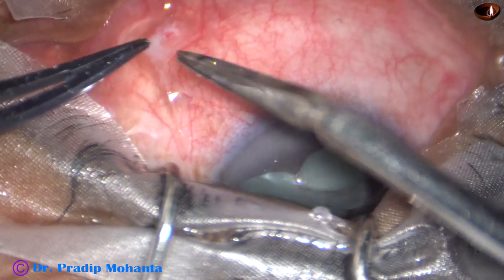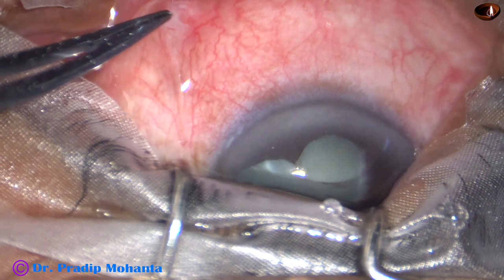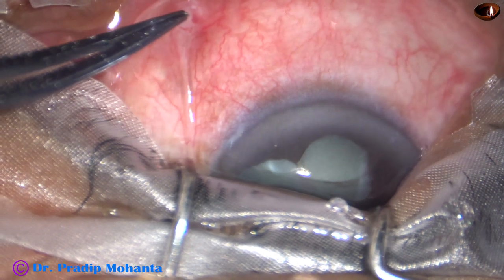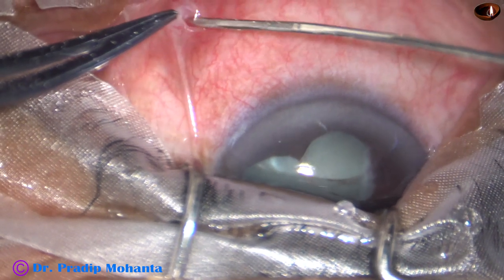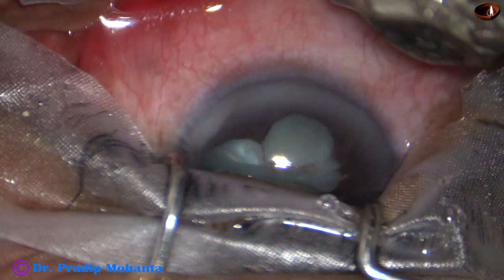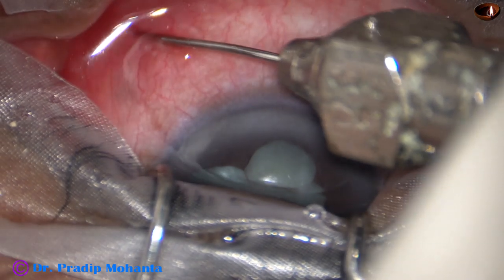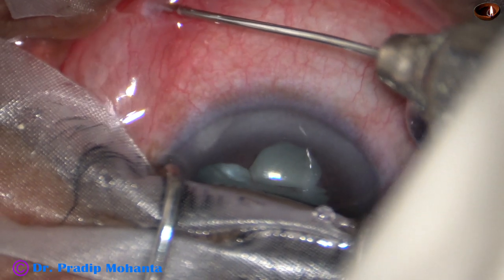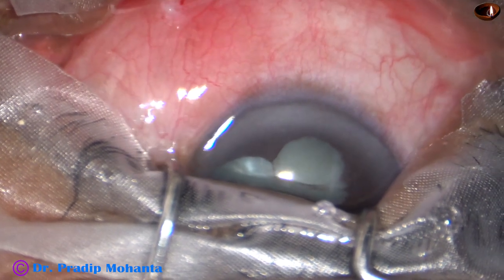After a nick in the conjunctiva and then another nick in the Tenon's, a blunt needle is passed through this opening posteriorly. This is the inferonasal quadrant. A blunt needle is passed posteriorly and then about 1.5 to 2 cc of lignocaine is injected in the sub-Tenon's space. And after a few minutes, this causes very good anesthesia.